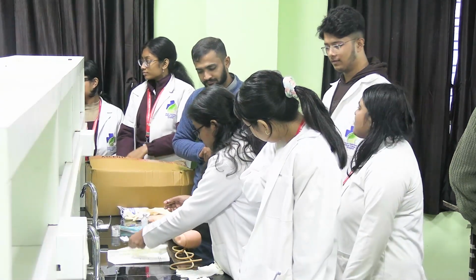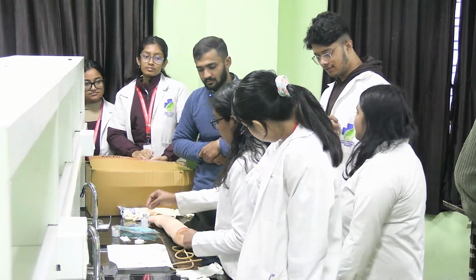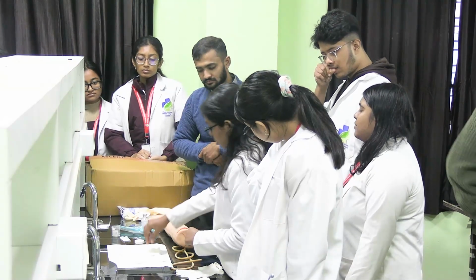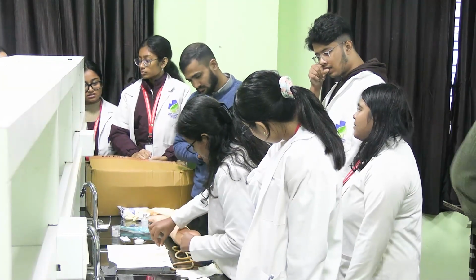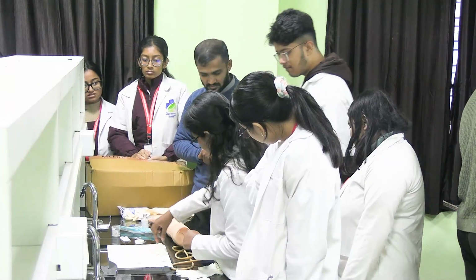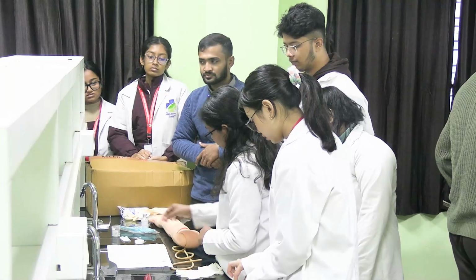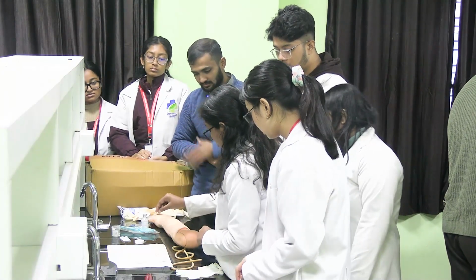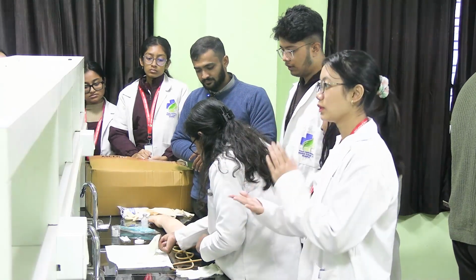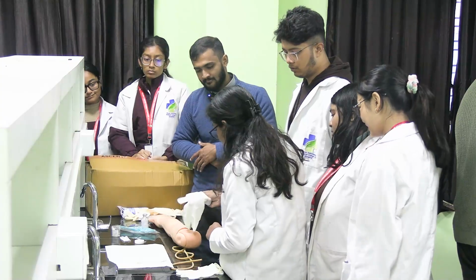Then I'll proceed with the sterile part of the gloves. You're touching the sterile part. The whole glove is sterile, but which part you should touch and which part you shouldn't matters. You are touching the most sterile part. Then left hand, help me with the left one.